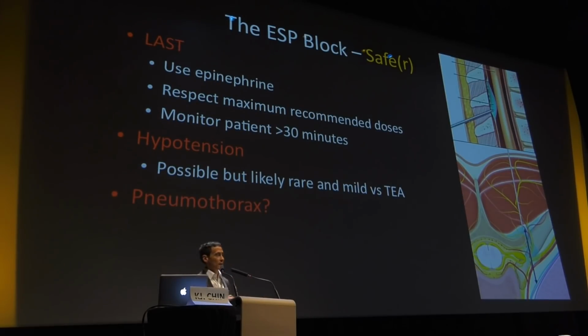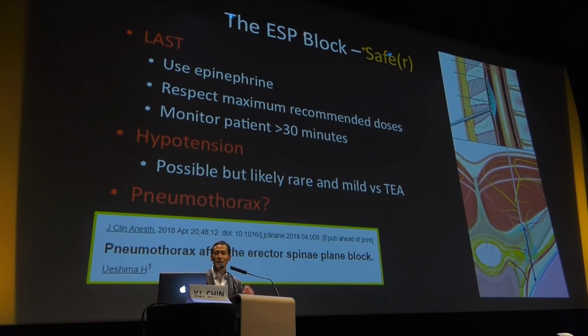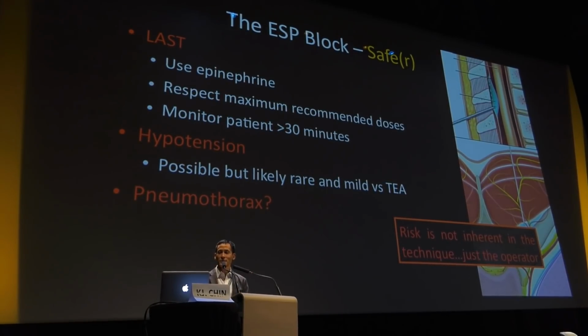Pneumothorax: you can see here that we are way distant from where the pleura might be when we target it. But having said that, I will say that there is one published report out of Japan with pneumothorax. My only response to this is that anything is possible. And really, I don't think the risk is something that is inherent in the ESP block, but if you choose not to perform it correctly, then as I said, all bets are off.